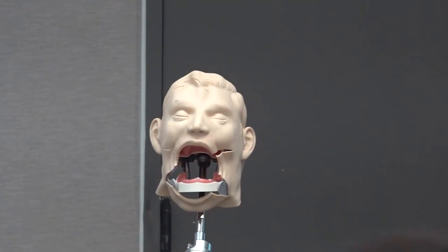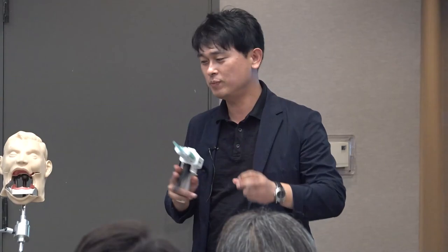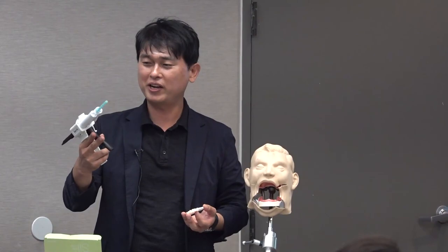You know, this silicone material was also developed by me. But I didn't make the silicone material itself, I adjusted the composition of the silicone material. So it's very cheap, but the ability is similar to 3M. Anyway, this is the tray type. Okay, good, and mix together.